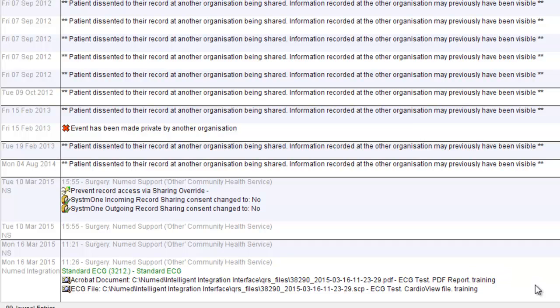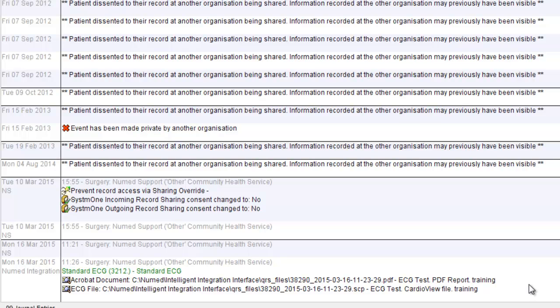The attached results report appears in two different formats, a PDF document and a CardioView ECG file. It's worth noting that the CardioView ECG file is a proprietary format. In order to view the results in this format, CardioView software has to be installed on every PC where the results are likely to be viewed. However, the PDF report can be viewed on any PC with PDF viewing software, which is commonly installed on most PCs.